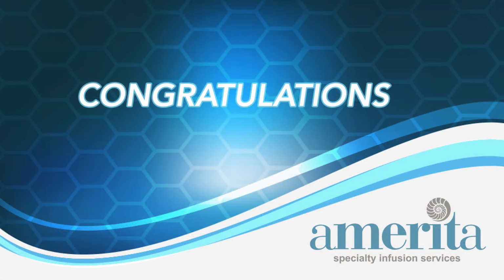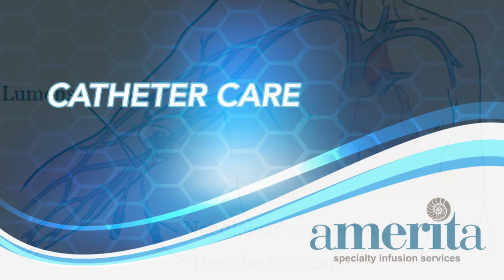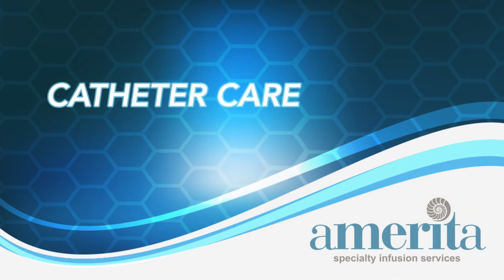Congratulations! You are now finished with administering your medication with an elastomeric device. If you have more than 1 lumen on your catheter, there are more steps to take to be sure that you keep all lumens open and ready for use. To learn more about that process, please look at the video that is titled Catheter Care.